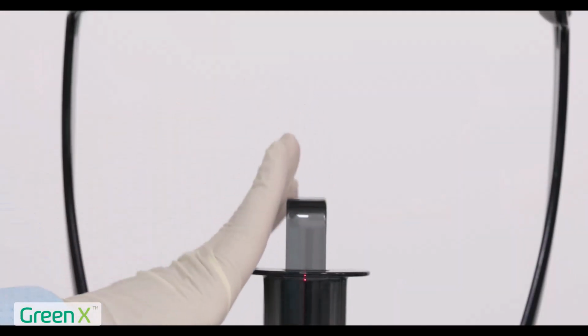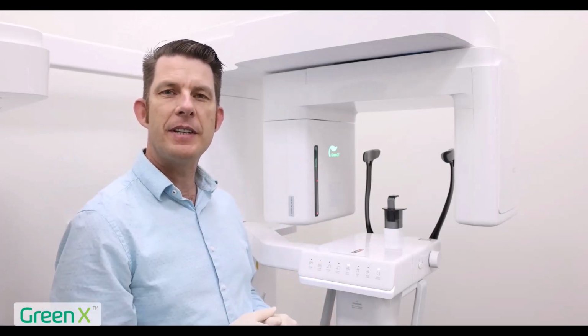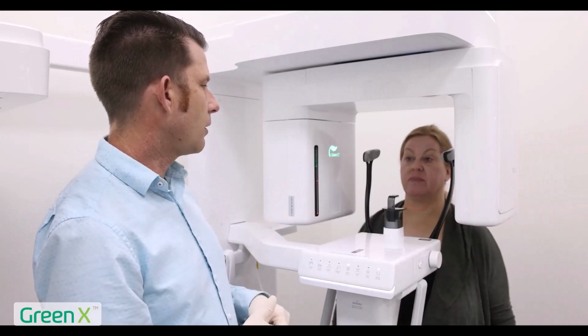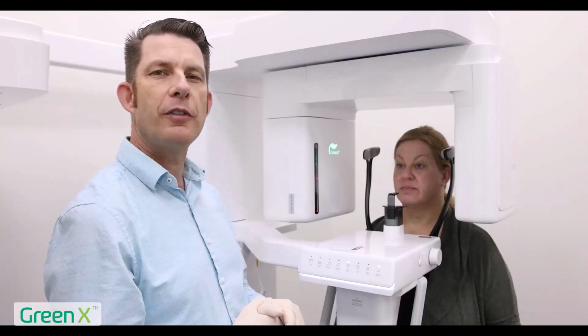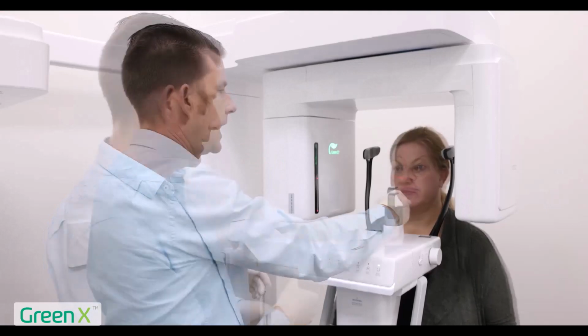We're going to leave the bite stick in for this demonstration. We're going to bring our patient back for CBCT capture. Stand up straight and tall for me. I'm going to go ahead and raise the column up. With CBCT capture, I want the patient with a flat occlusion, the occlusion being parallel to the floor.